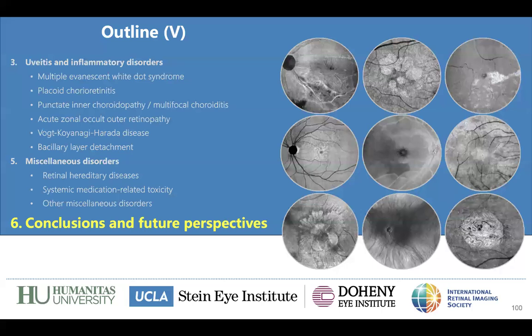I remember there was a meeting here in which we were attending a course, and they had a Dream OCT. Of course, it was a really short experience, but I think the segmentation algorithm is a little bit different and works a little bit better, though it was just a handful of patients that we tried.